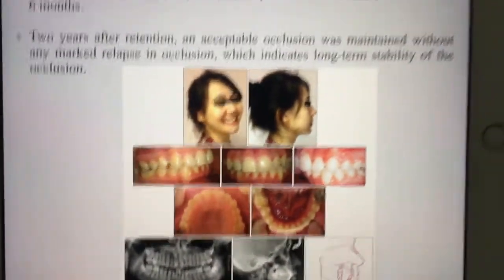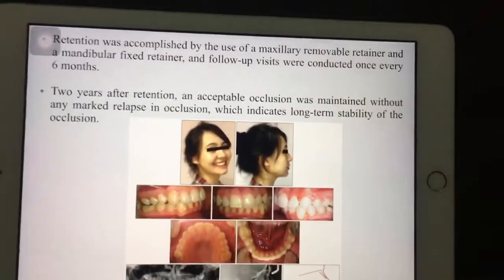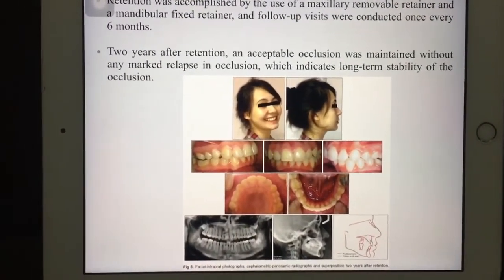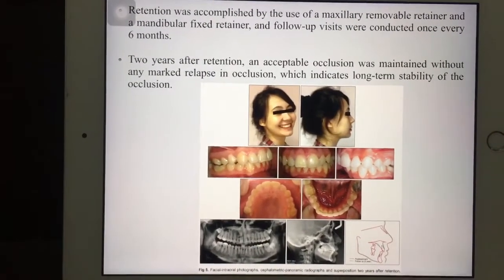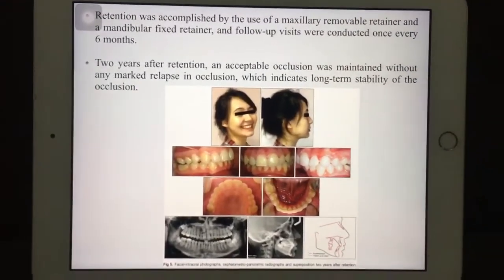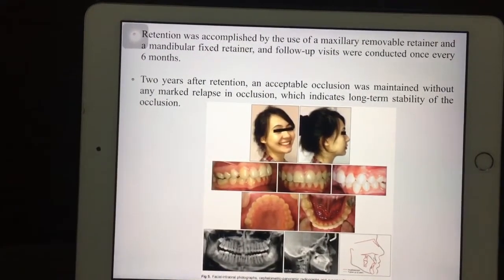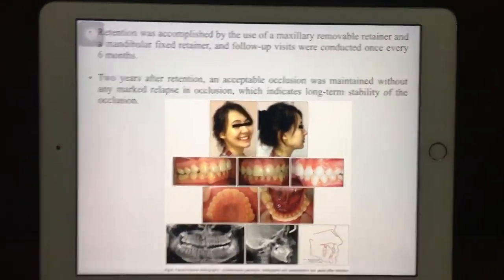So, in conclusion, the trombone appliance was effective for correcting mandibular arch crowding and represents an acceptable method that can be used successfully in young patients with early mixed dentition as well as in adult patients with permanent dentition. So this trombone appliance is considered a slow arch expansion or dental-alveolar expansion. So changes are primarily dental changes with a minimum amount of skeletal changes.